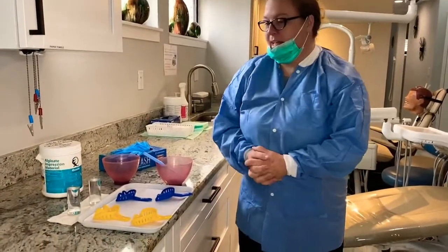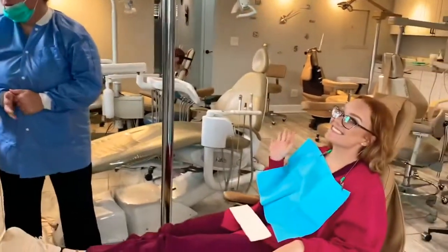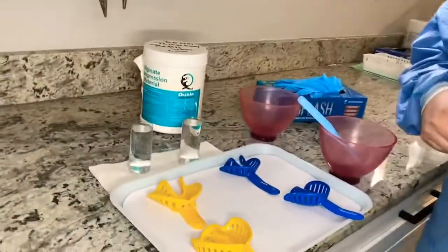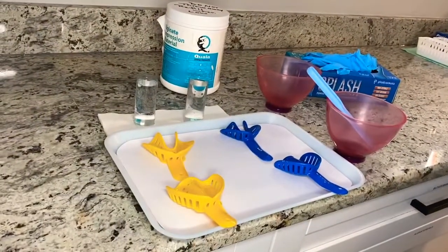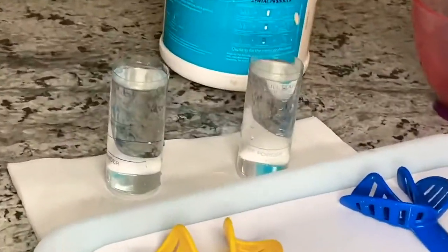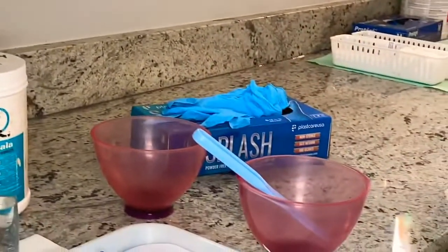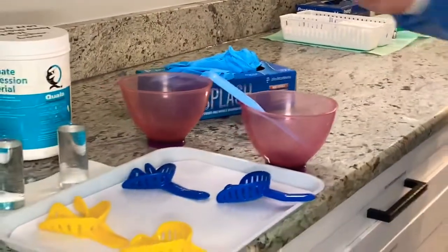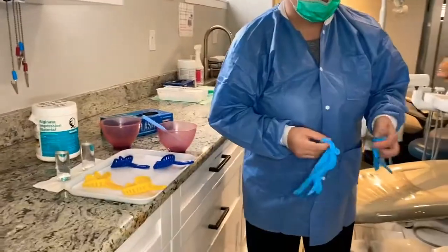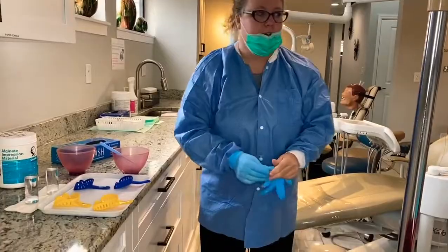Today we're going to be taking alginate impressions on our patient for study models. We have our setup over here — different size trays to try in the patient's mouth to make sure they fit. We have our water at the three mark, we have our alginate. We're going to fluff it and then put three scoops in each bowl. I'm going to put on gloves and then try in the trays in the patient's mouth to see which trays we need, and then get our alginate ready.